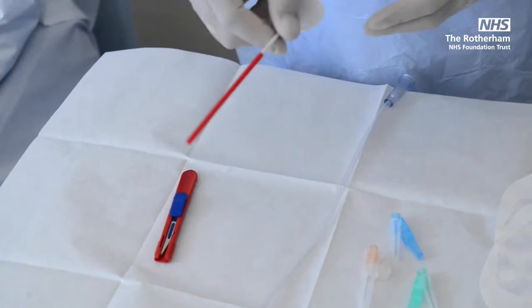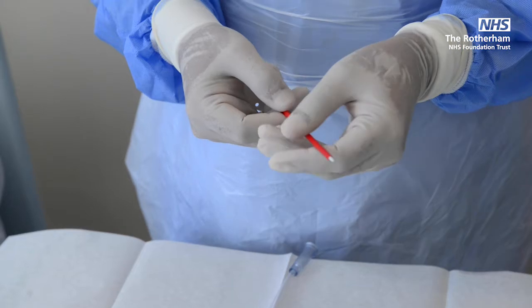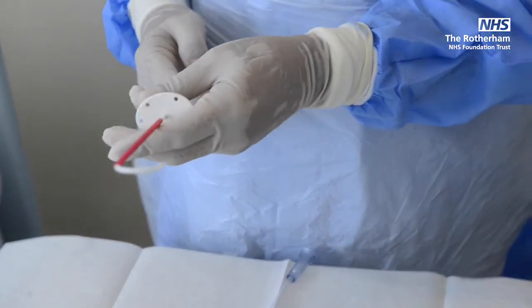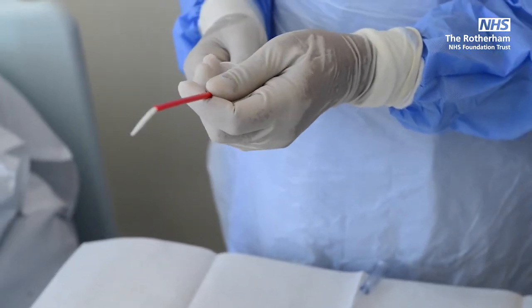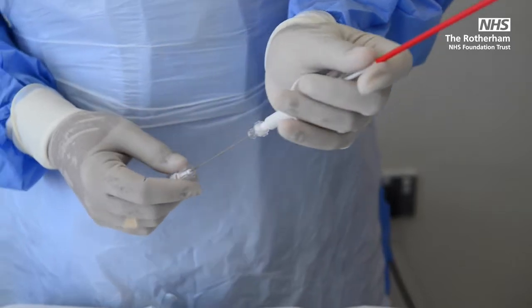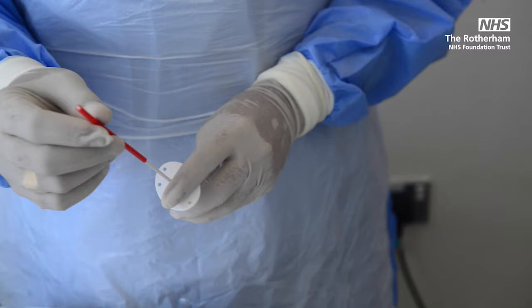We've got the Rocket multipurpose needle drain, which has got holes at the tip, and it is curved initially. So if you see, it comes like this. You have to straighten this with this red tube. It goes all the way up to the tip, and then you insert the needle all the way through so that it comes out of here.